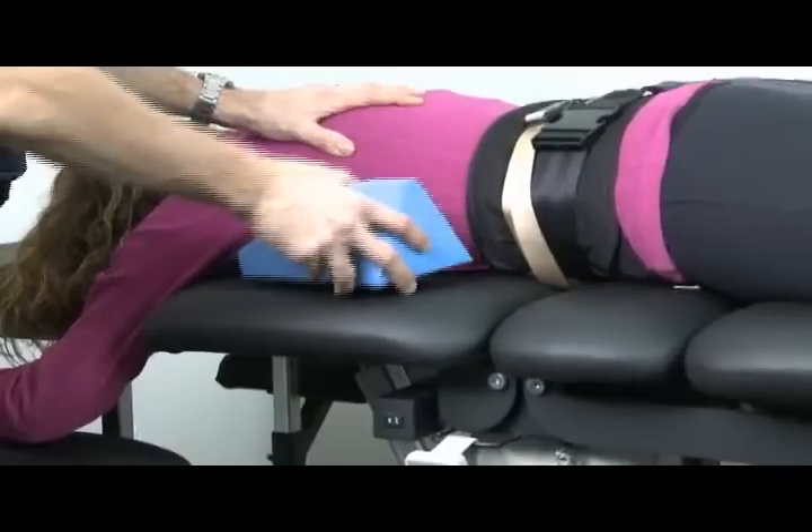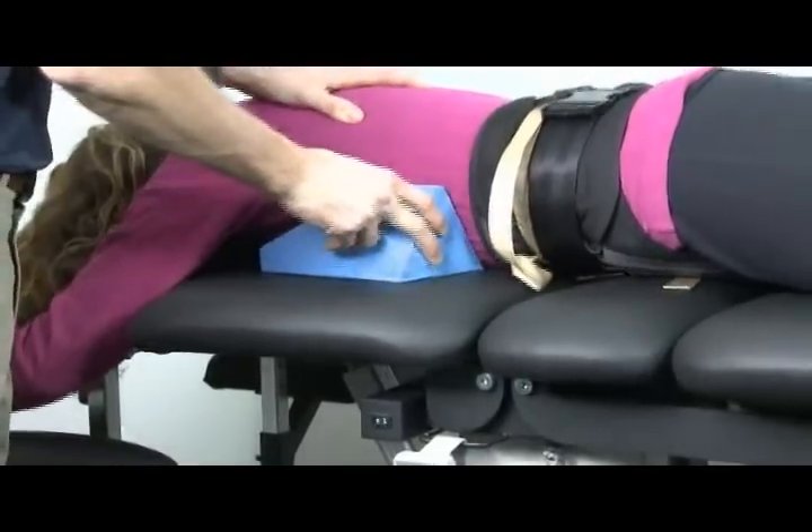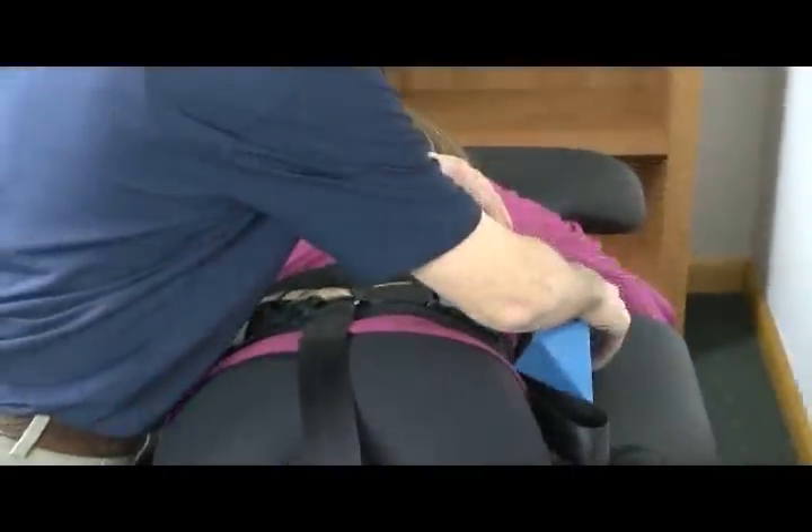If using slip stop blocks as a thoracic restraint, simply place the blocks as shown by having the patient roll slightly to one side and then the other.